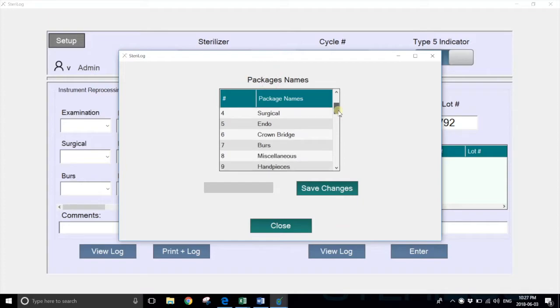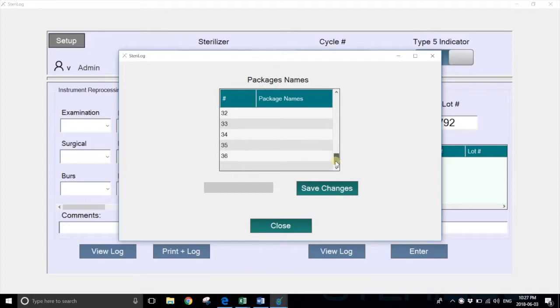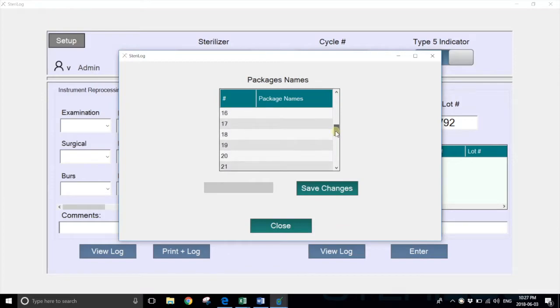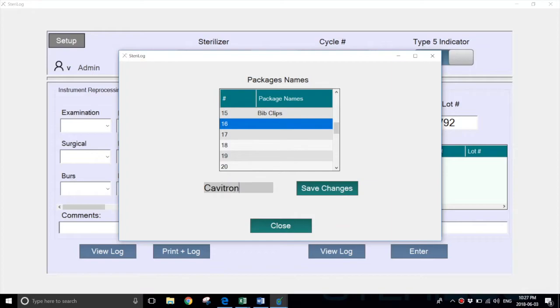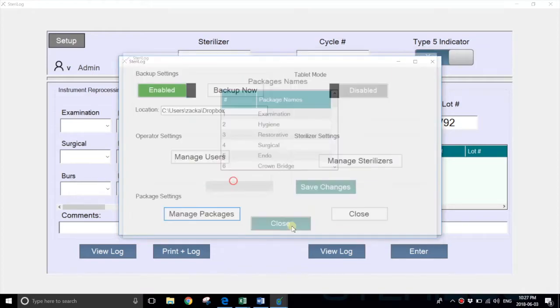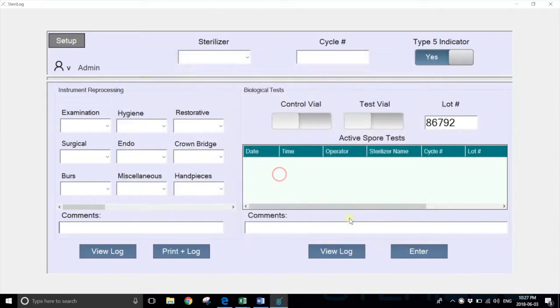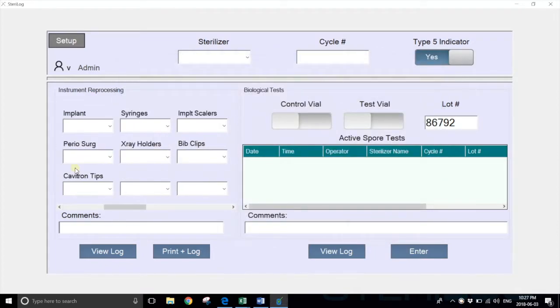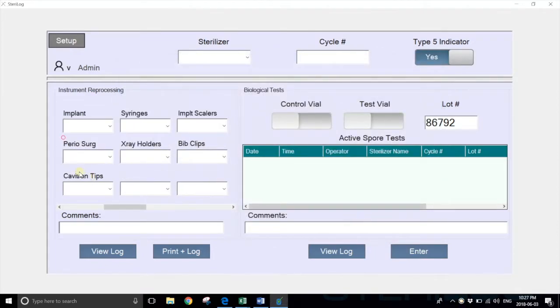If you scroll down, you can see there are up to 36 fully customizable package names that can be added. For example, if we wanted to add Cavitron tips, we simply key it in and hit save changes. Then when we go to the main dashboard, you can see that Cavitron tips has been added.